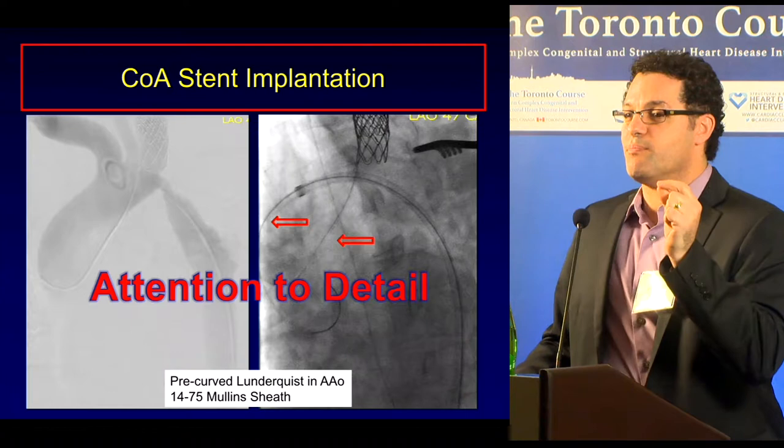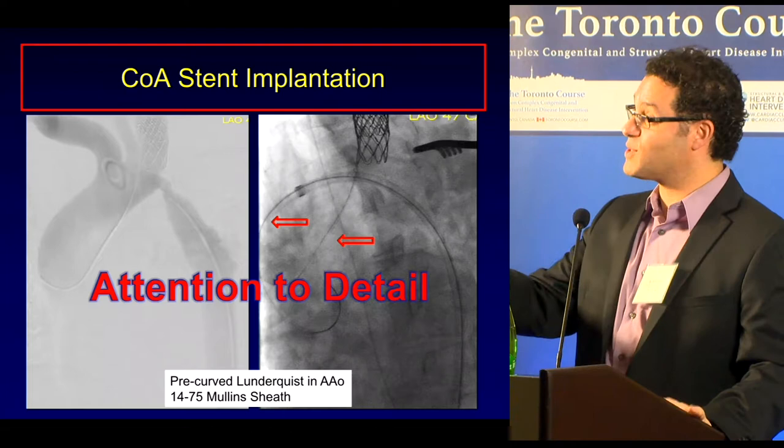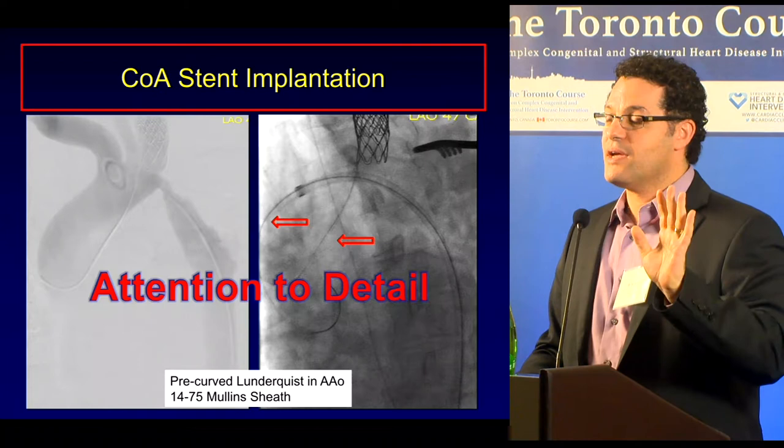So back to basics. Don't let the surgical resident touch a piece of equipment. Touch the wire. No, it wasn't so... They can hold the wire until I see that it's in the wrong place, then I will take the wire from them. Yeah. So the surgical resident? The pigtail went in. I didn't know who was who at that point. I thought it was a fellow.